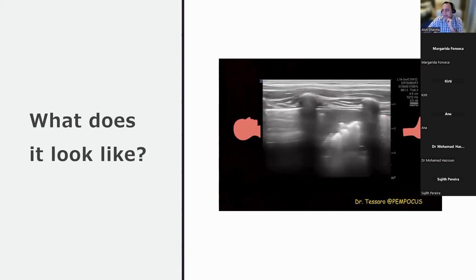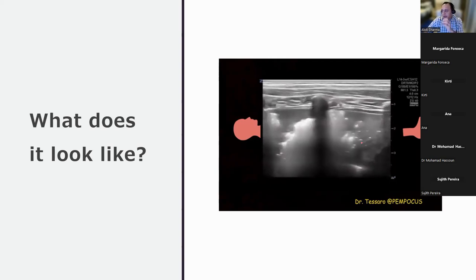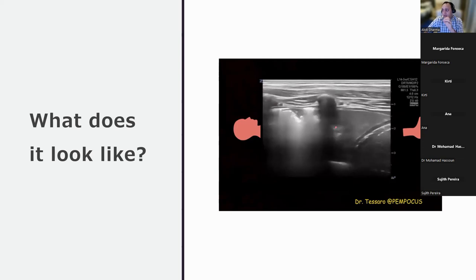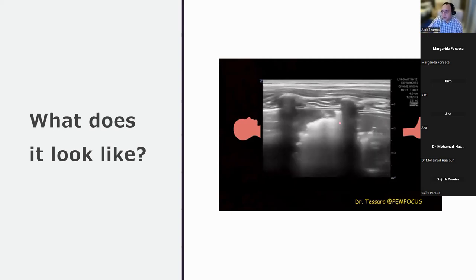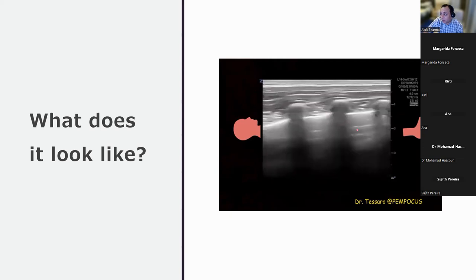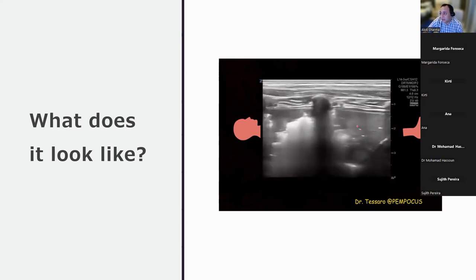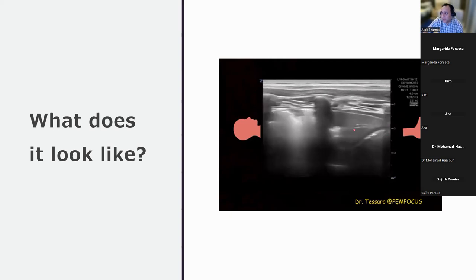Now, compressive atelectasis is very different to focal subpleural atelectasis, and it is there because of a pleural effusion. And often where you have the consolidation, and this is really important, people talk about atelectasis not having dynamic air bronchograms. But really, when you have compressive atelectasis, you can have dynamic air bronchograms coming in from the consolidated area of lung that's aerating into the collapsed area of lung. And you can see that over here. You can see dynamic air bronchograms come in and out just at the bottom, just over there.